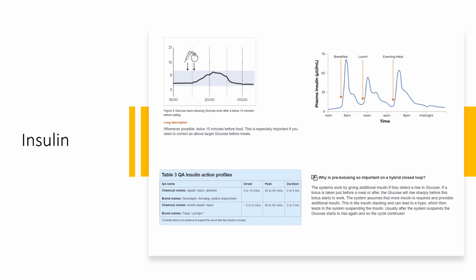Quick-acting insulin is introduced as a topic in Week 1, as this is the only type of insulin used in a pump. Basal insulin is introduced in Week 5 as part of the topic Problems with your insulin pump and going back to pens. The importance of bolusing 15 minutes pre-meal is included as it is clear from CGM results that pre-bolusing makes a difference to postprandial glucose and time in range. The importance of pre-bolusing for hybrid closed loop users is also emphasised.